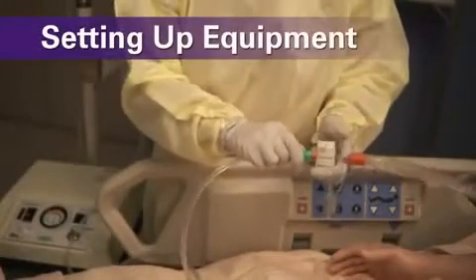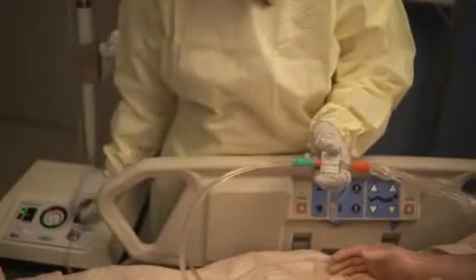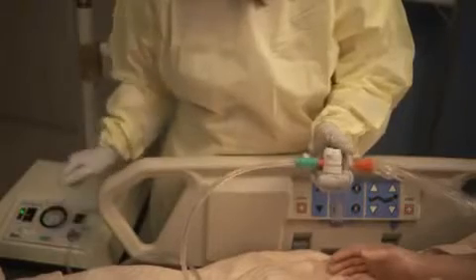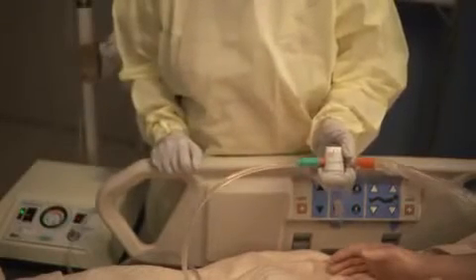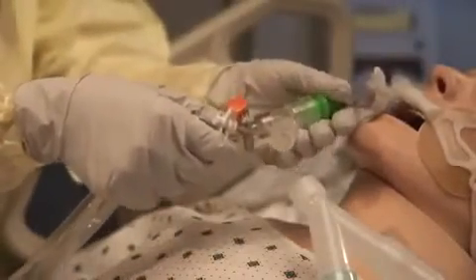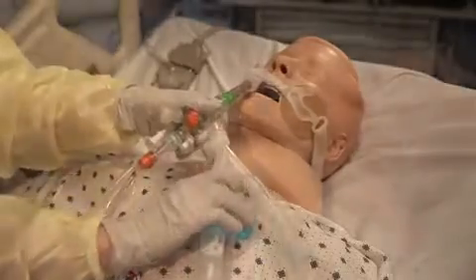Next, attach the thumb control valve to the suction tubing. Depress and hold the thumb valve and simultaneously adjust the vacuum regulator to the desired level. Then release the thumb control valve and attach the KimVent MAP closed suction catheter between the patient and the ventilator circuit.